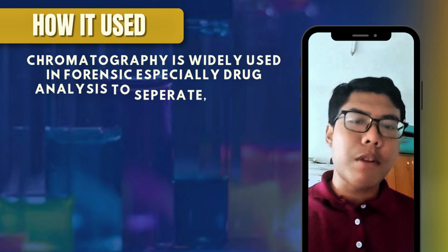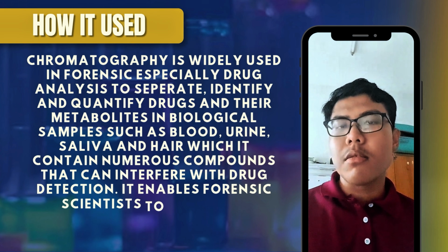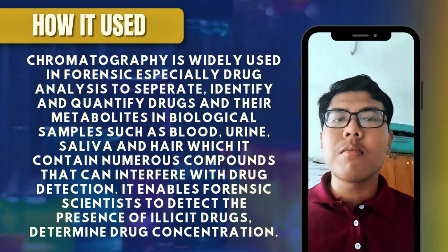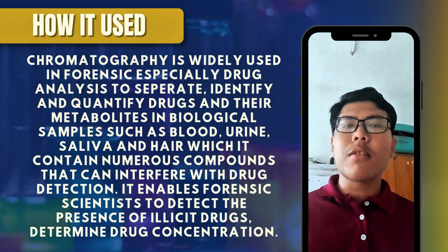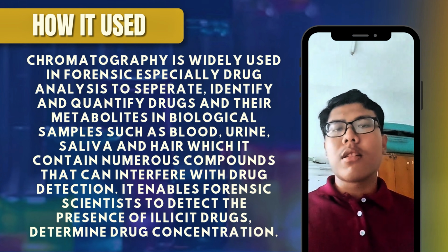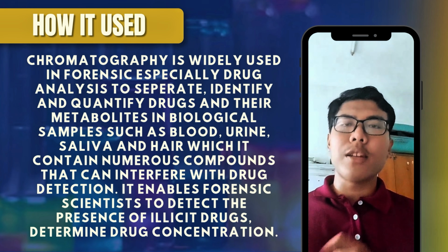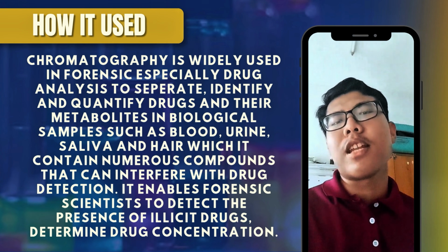Chromatography is used in forensic science to detect drugs in our body samples, such as urine, saliva, blood, and hair. It separates the drug from other substances that we don't need. So, by that, the scientists can easily detect the drug, and scientists can also know the amount of the drug present in our bodies.